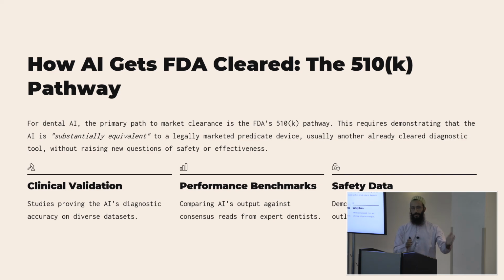And so each of them has to pass statistically on its own in order to be allowed to be shown in front of patients. And so the difference is pre-clinical trial, we could show all of the AI detections, whatever we wanted, but it had to be not in front of a patient, like a patient couldn't see it. Post-clinical trial, it can be shown chairside in front of a patient. That's the fundamental thing that the clinical trial allows each of these companies to do. So if it's chairside, that means it should be FDA approved.